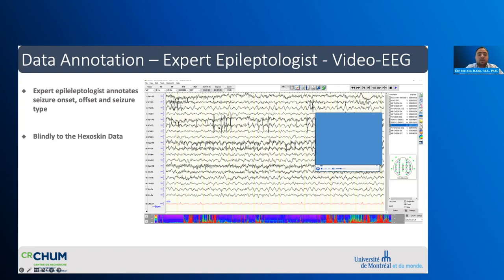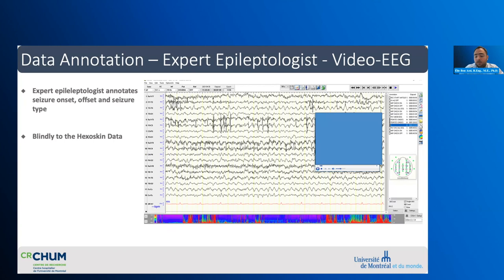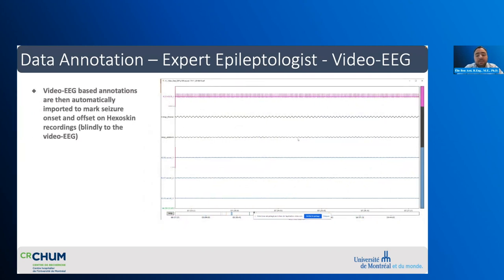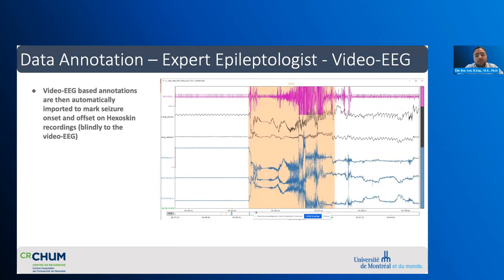Seizures are annotated by an expert epileptologist based on continuous video EEG recordings, blindly to the Hexoskin data. This is the EEG — the recording of the brain's electrical activity as recorded with electrodes glued to the skull. A good feature of the Hexoskin is that it allows a universal time so these annotations can be applied to Hexoskin recordings. Video EEG-based annotations are automatically imported to mark seizure onset and offset on the Hexoskin recordings. This is a screen capture of our local Python-based processing pipeline, with a focal to bilateral tonic-clonic seizure highlighted in orange.